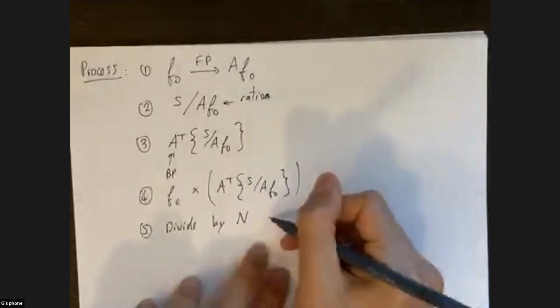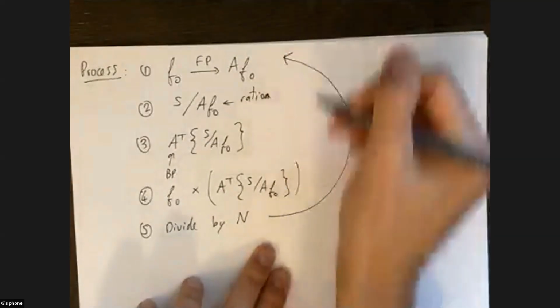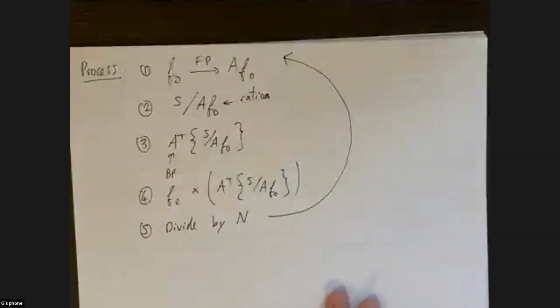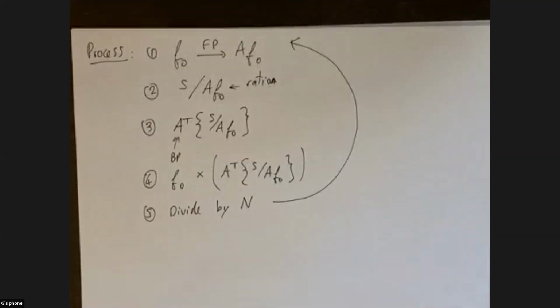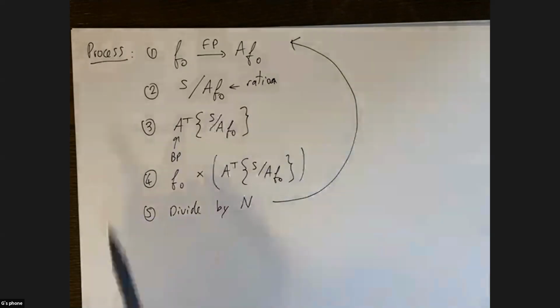And then once we've done that, because it's an iterative method, the process is repeated a number of times. How many times is it repeated? It depends on the goals of the reconstruction, the level of detail that's aimed for. It depends on the amount of noise. So there's some criteria essentially. Either the algorithm will be run for a set number of iterations or until some criteria is reached. Okay. And so this is the key reconstruction method for PET and SPECT.